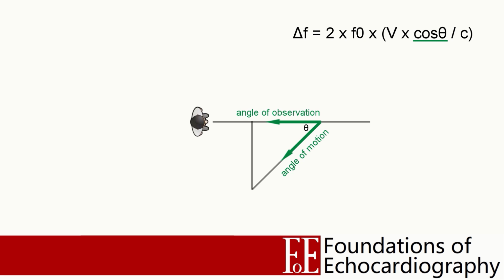When the car passed in front of a man, theta was 45 degrees. The cosine of 45 degrees is approximately 0.7, so our calculated velocity is approximately 70% of the true velocity. This is why, whilst the car was travelling at 9.2 meters per second, the man estimated the speed of the car at 6.5 meters per second.